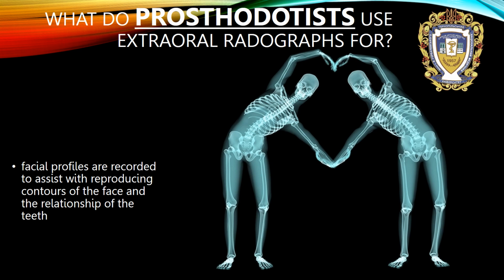Prosthodontists use extraoral radiographs for facial profiles. Facial profiles are recorded to assist with reproducing contours of the face and the relationship of the teeth.